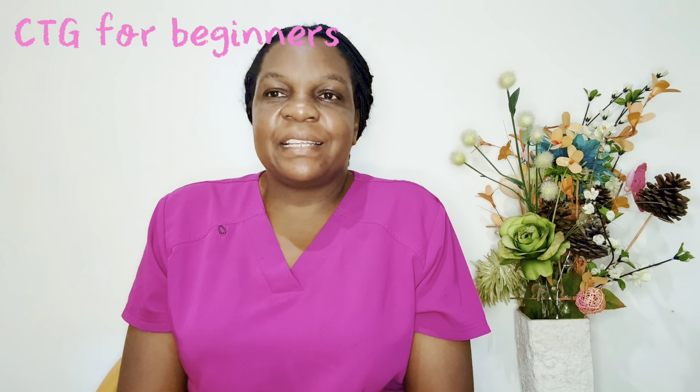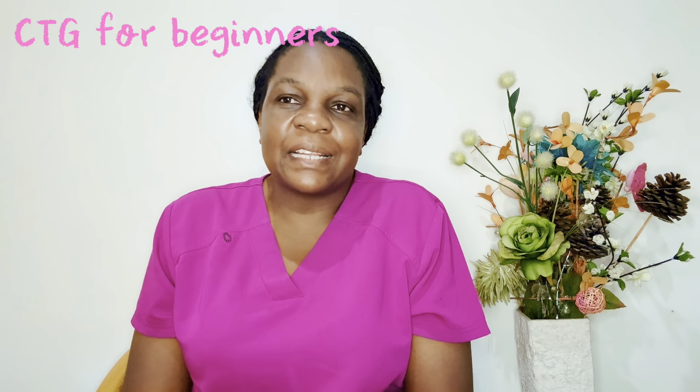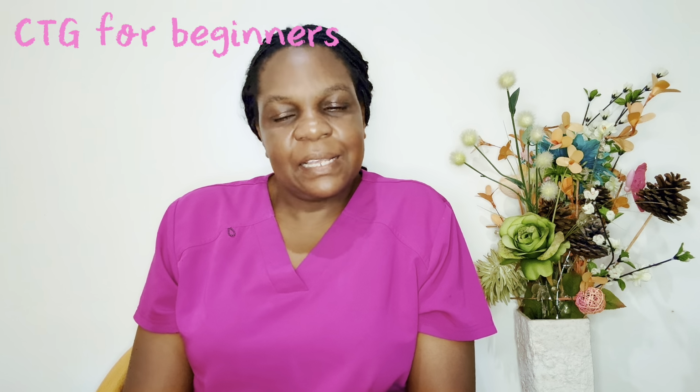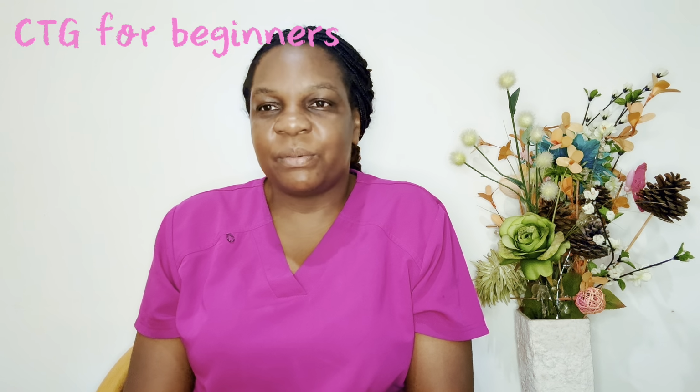So for easy understanding, we are going to answer those 4 questions that I've discussed so that we understand each type of deceleration. The first question is, when did it start in relation to the contraction? Number 2, how deep was it? Number 3, did it recover quickly? And number 4, does it keep happening? Let's use these questions to understand each type of deceleration in a way that's easy to remember.